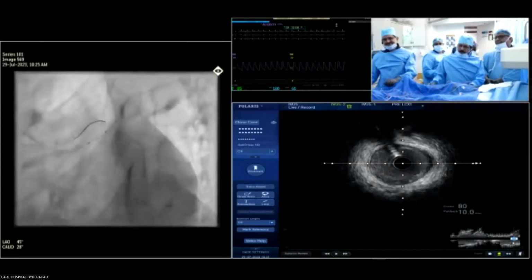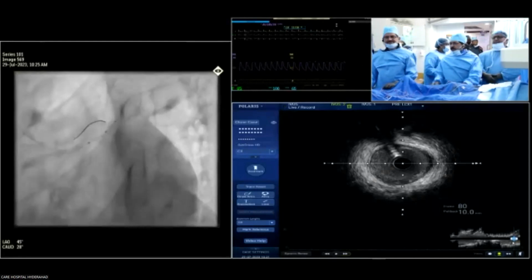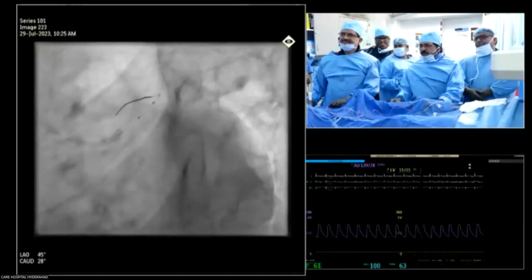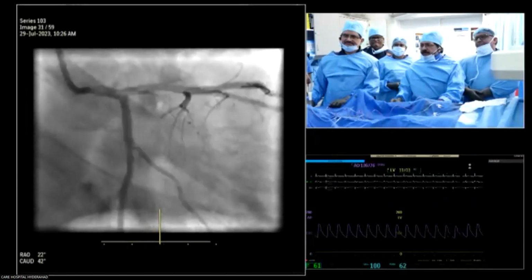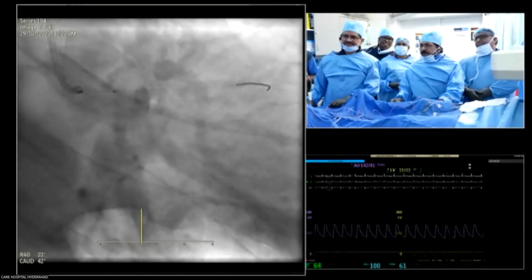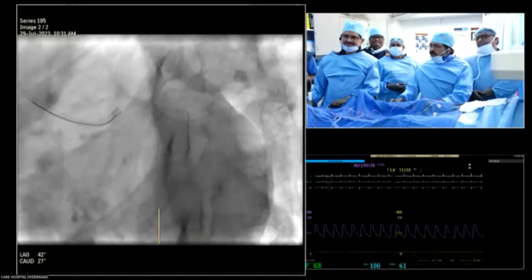To your point, from Dr. Surya Prakash: you can see the steps we have done. We removed the wires in the circ and crushed the stent, whatever little 1 or 2 struts of protrusion in the left main. This is the end result, looks very good. I usually do this technique. You see the 3 mm balloon going so smoothly and there is no obstruction. Absolutely. So then the result shot, you show that.